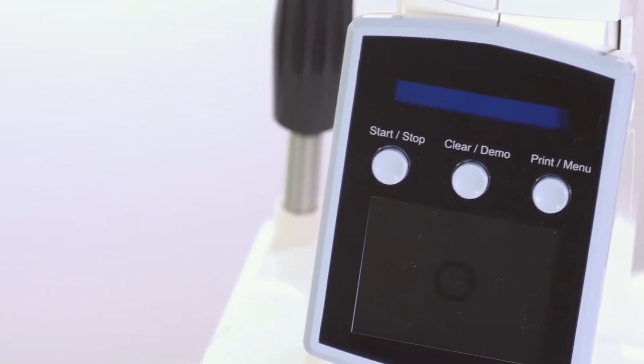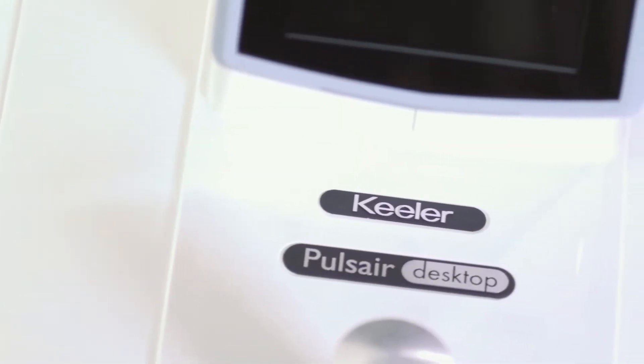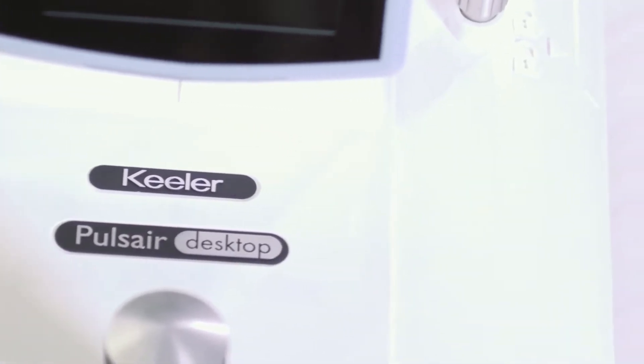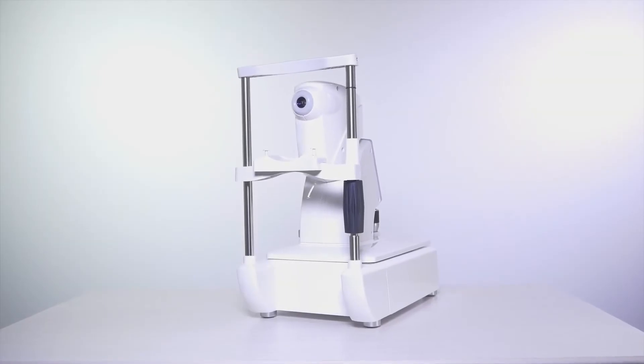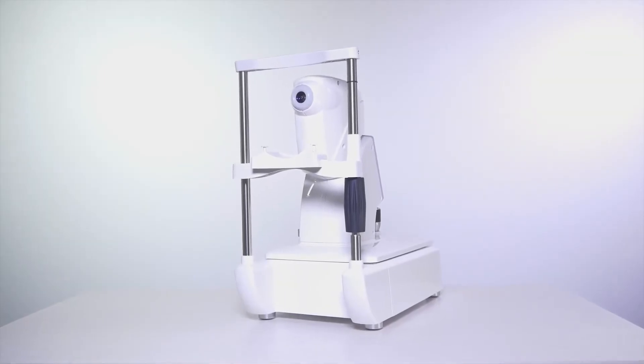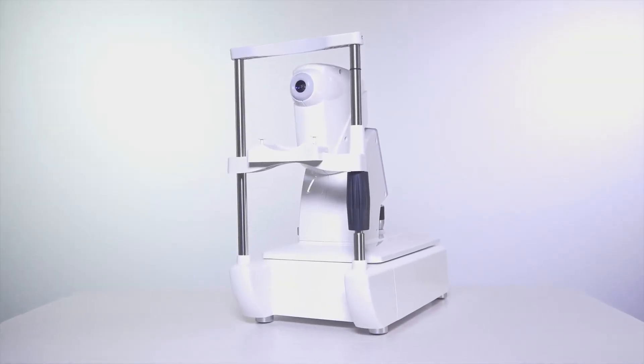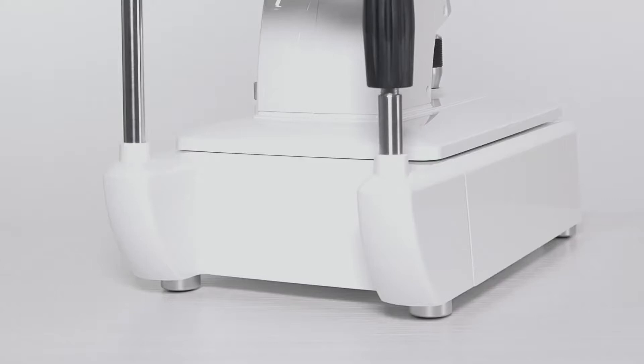The color alignment screen and smooth alignment makes the PulseAir easy to use and accurate. The PulseAir is designed for use on a sturdy flat surface like a medical instrument table. Make sure the four anti-slip feet are located well within the edge of the intended flat surface.